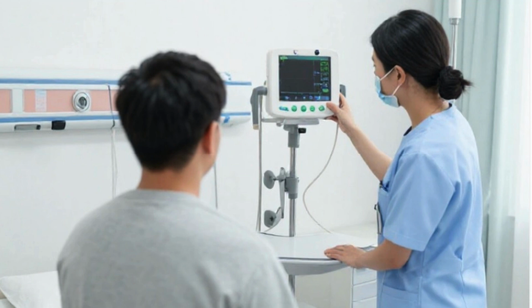Alarms are designed to alert medical staff when a patient's vital signs exceed preset limits. Alarms can be visual, audible, or both. While alarms are essential for patient safety, improper alarm settings can lead to alarm fatigue, where staff become desensitized due to frequent non-critical alarms. Therefore, correct alarm configuration is crucial.